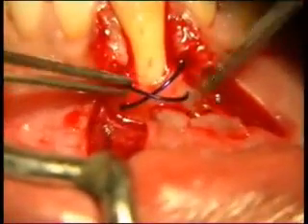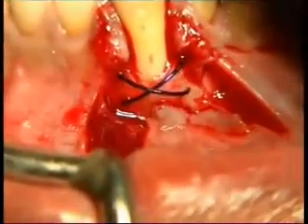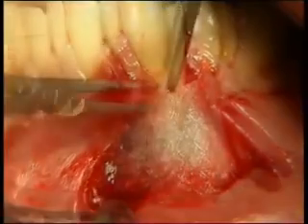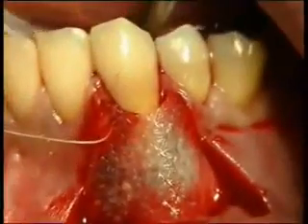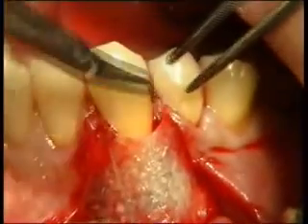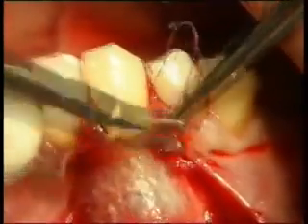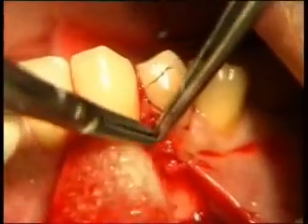The resorbable membrane Resolute is trimmed and moulded above the exposed root in order to completely cover the bone defect, extending about 3 to 4 millimetres beyond the vestibular defect, with the aim of positioning it firmly to the bone base. Once the desired curvature has been obtained, the membrane is positioned below the previously disepithelialised and peeled papillae. It is sewn to the amelocementum junction around the tooth with a simple interrupted suture — a sling suture — using a resorbable suture of polyglycolic acid, Dexon-2.